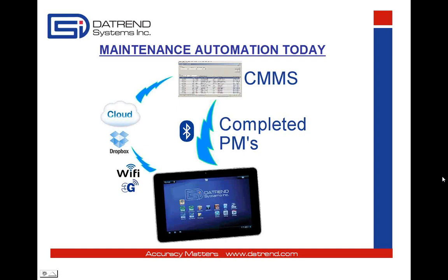Similar to a system that works with a MedTester, the CMMS may have the ability to close open work orders and update the equipment inventory automatically. As with the original MedTester Sentinel system, there is no paperwork involved.